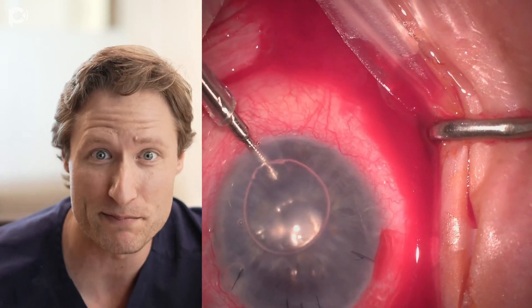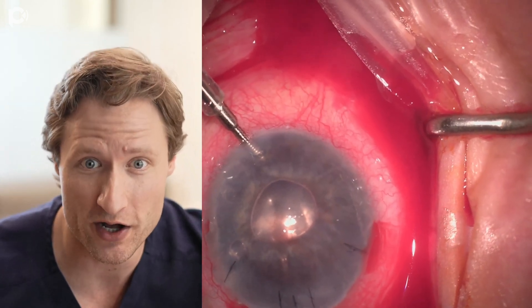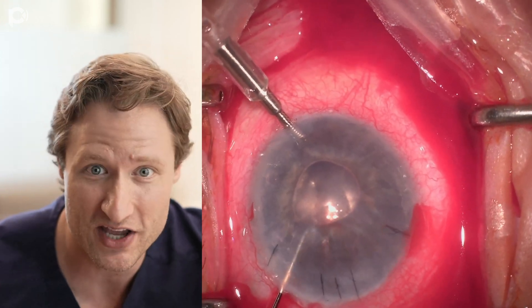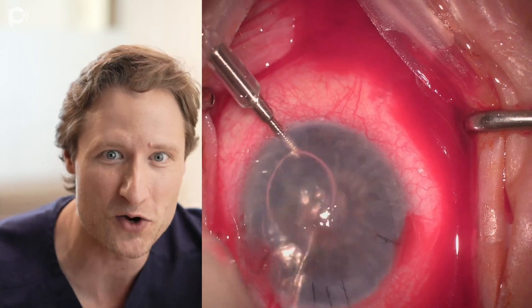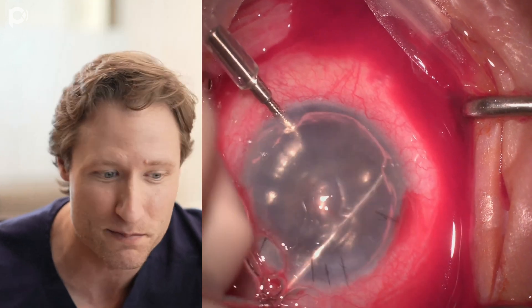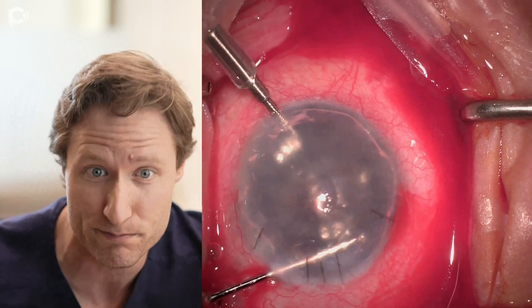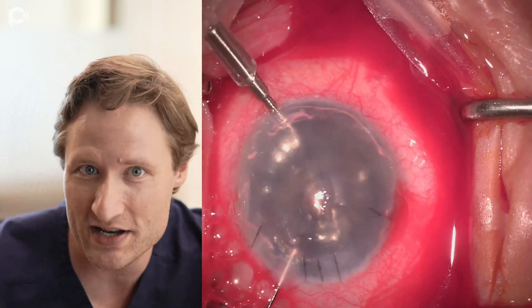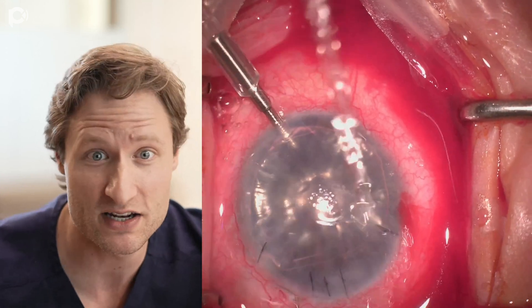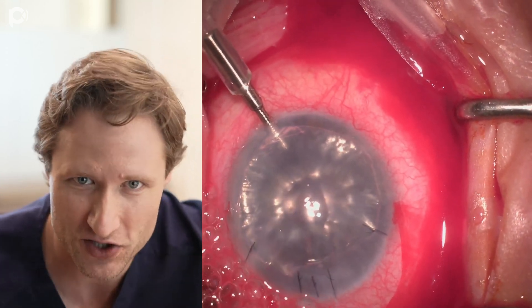I believe it's good to do operations not necessarily quickly, but not to dawdle either. You don't want the patient on the table any longer than necessary, and the longer you work on an eye, the more chance you have of a problem. It's better to focus and be efficient. But I spend a long time stripping this Descemet's membrane because it's really important. If you have unstripped shreds of Descemet's membrane left in the eye, it can contribute to lots of problems — it can precipitate detachments, and it makes the eye look ugly after the operation.